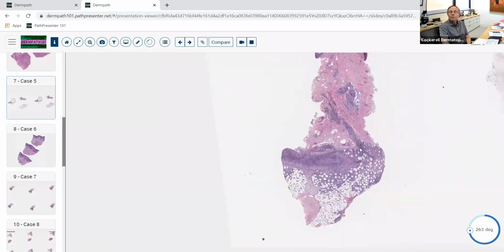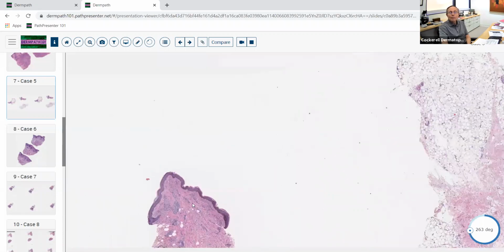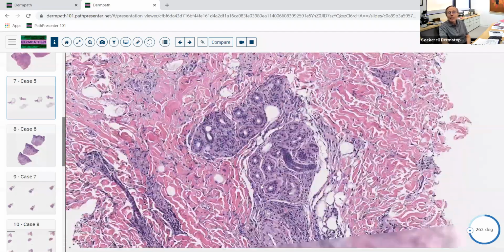And especially if you see, not in this biopsy, but if you see abscesses, epidermal hyperplasia, small areas of pseudoepitheliomatous hyperplasia, that is a very common pattern for an infection like an atypical mycobacterial infection or a deep fungal infection, something like that. So suppurative granulomatous dermatitis with pseudoepitheliomatous hyperplasia, with abscesses, transepidermal elimination of organisms, things of that nature, think about one of those infectious processes. If you see something like this, this was one that we signed out as a suppurative granulomatous dermatitis, possibly an infection. Special stains were done in this case.